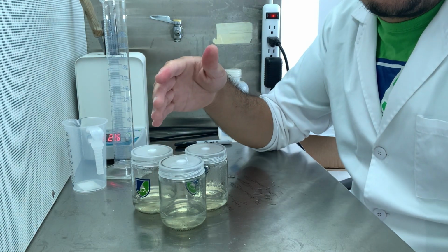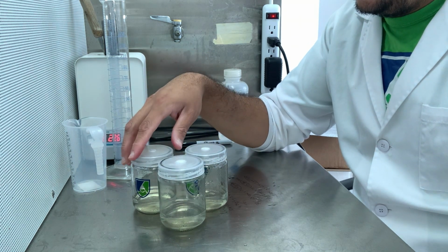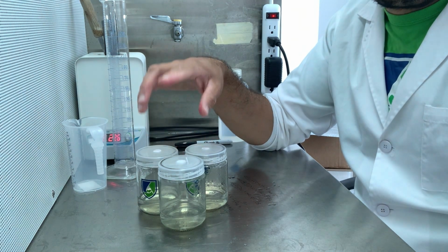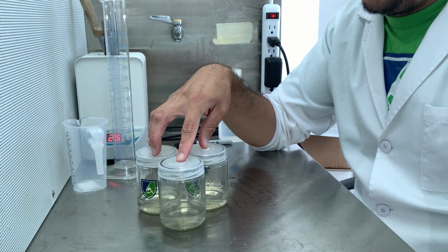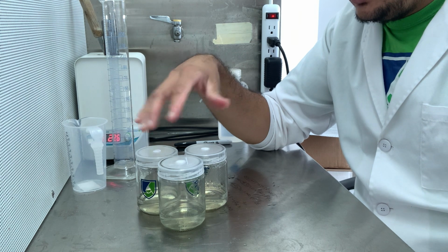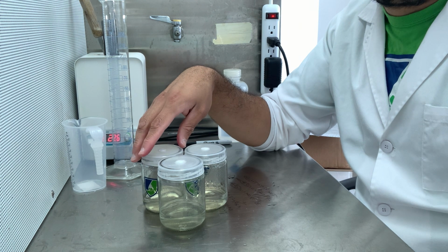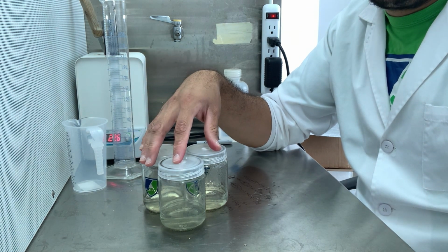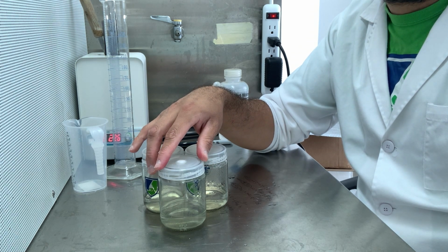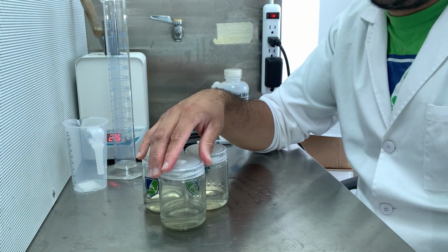Now, if you have an electric pressure cooker and you don't want to invest in another pressure cooker, what you can do is take the flasks like this, put them in the microwave at 50% power for 10 minutes, and that is usually a good protocol to sterilize the flask. I have a very good success using that. Now keep in mind my microwave may be different than yours. Mine is a Whirlpool and it is 1000 watts and 50% power for 10 minutes usually works very well for me.